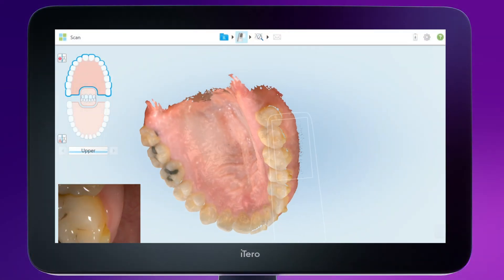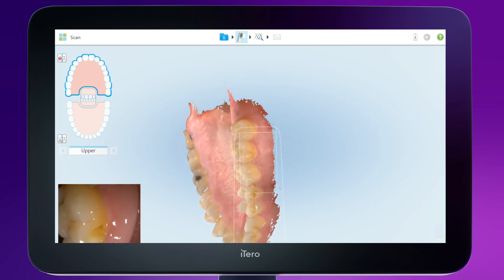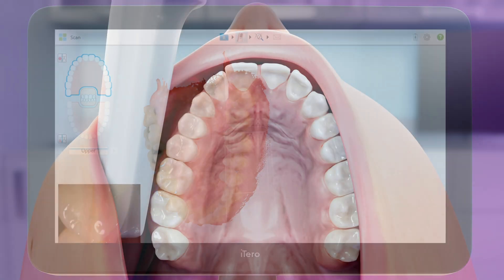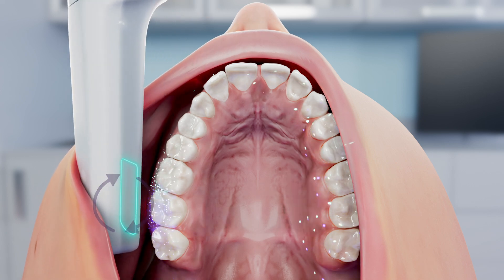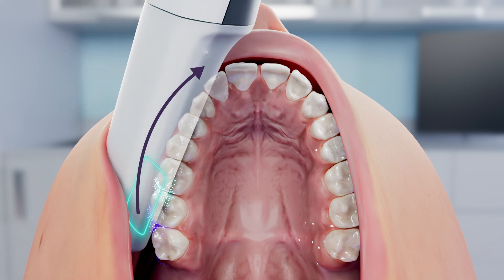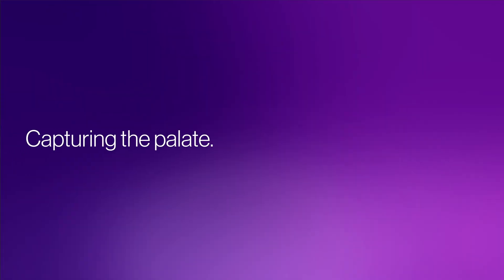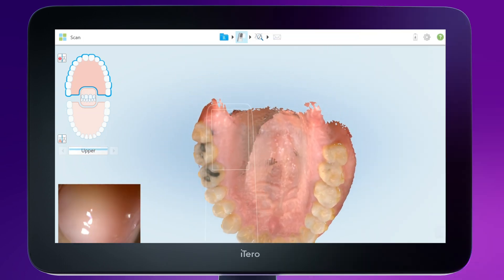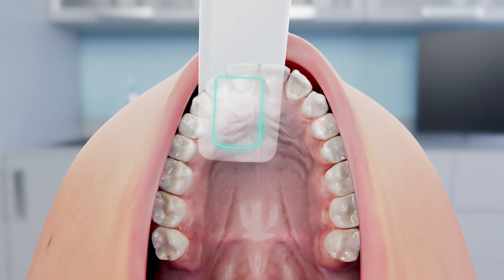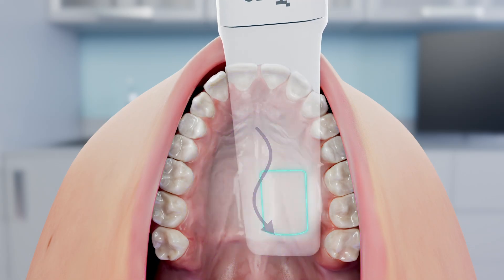It could also be helpful to ask the patient to relax their jaw and slightly close their mouth, which will allow the wand to move further. If the patient has enough flexibility in the cheek, you may also slightly tilt the wand to the buccal, moving further from the cheek and dropping the wand down while retracting the distal part. When scanning the upper arch during the occlusal sweep, you may notice that the palate is being built. Continue scanning it at a closer distance to ensure that all the palatal anatomy is captured.